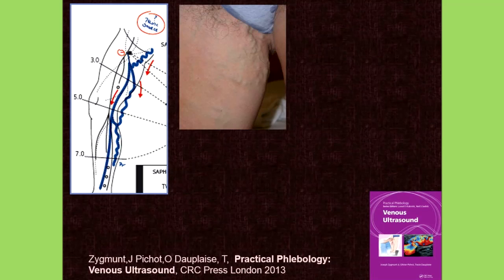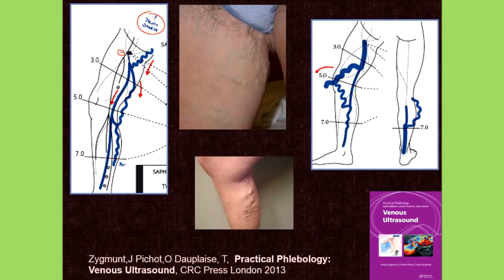Now, the veins that you see in the middle of the screen top, those are obviously non-saphenous in origin. That is, those are coming from the perineum, likely from the pelvic insufficiency, either gonadal veins that are incompetent or pelvic varices, periuterine varices that extend down the leg, and in some cases that saphenous vein is completely competent above where those enter, and then it's incompetent below.